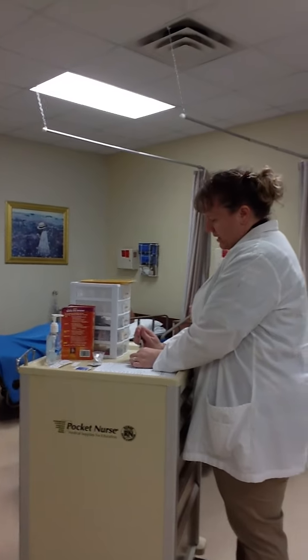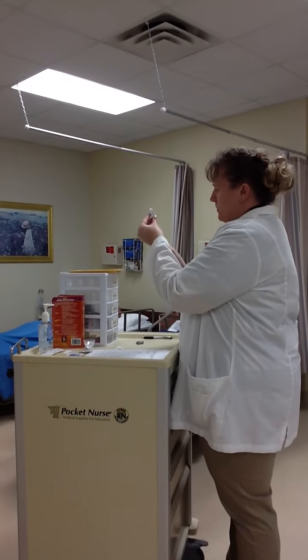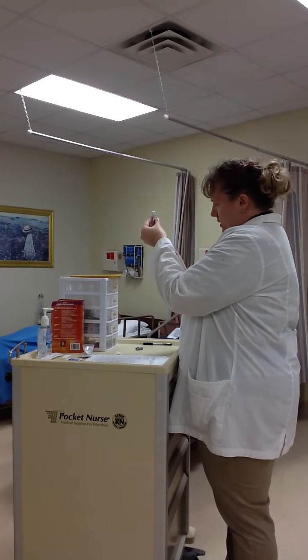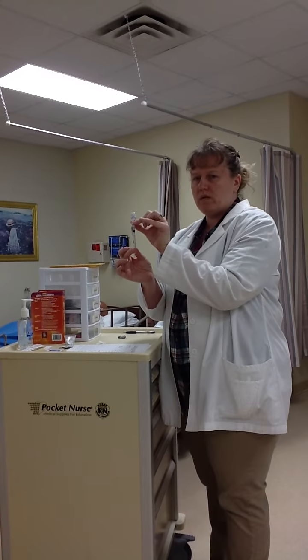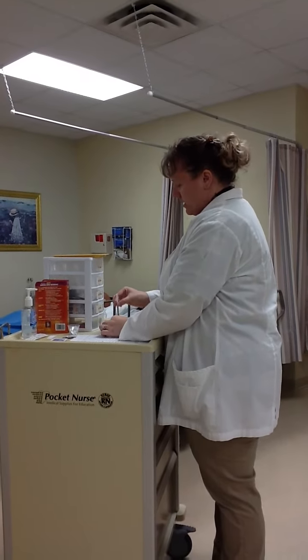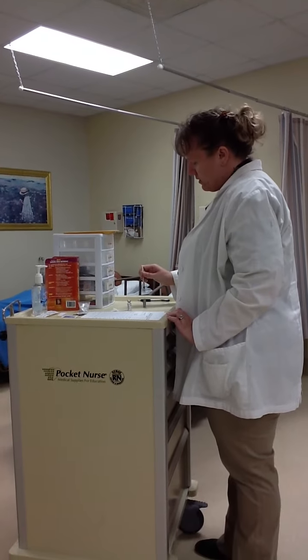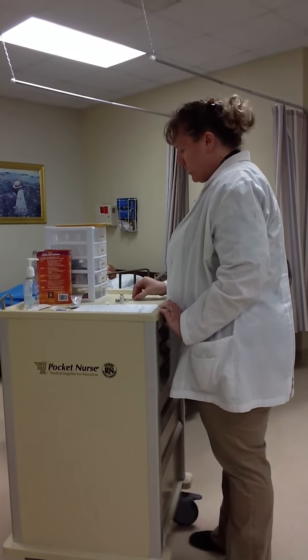Once I pull that top off, I'm going to insert that air to 0.1, rotate that bottle, pull it back, making sure I do not have any bubbles in my syringe. I'm going to show this vial and the syringe to my instructor. They've seen it. I'm then going to rotate it back, set it down, and pull that off. Anytime you recap a needle, either lay it down and slide it in, or with these, they stand up tall, put it back in, it is now covered.